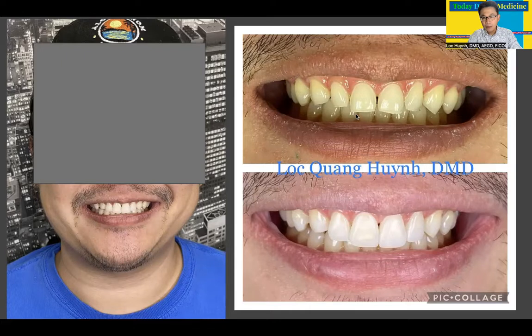So again, in step number one, when you create the incisal length on the lingual side, you need to know exactly how much length you need, and then you trim it back. Don't leave it too long. My problem was I left it too long. I didn't have any conception of how long it's supposed to be, and then I put it really long, and I had to work hard to trim it back. That's one of the biggest reasons why it took me so long to reduce that, and so much effort to try to make this symmetry.